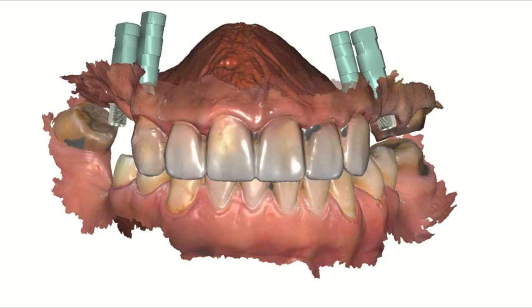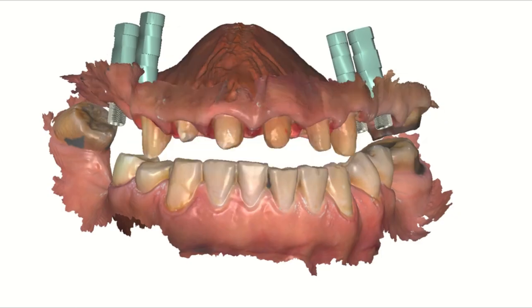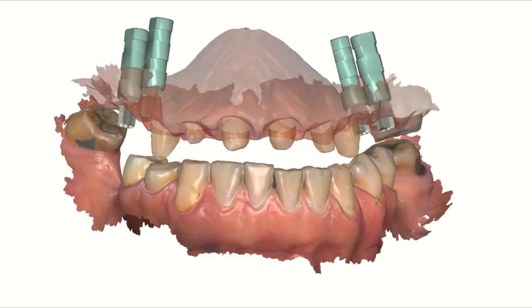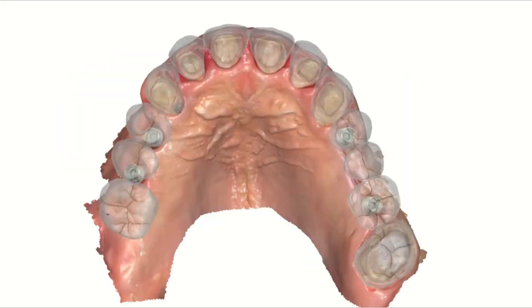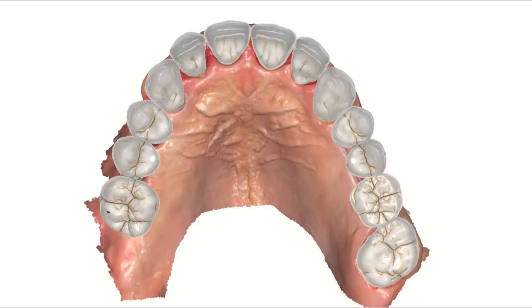Here is the case before preparation of the anterior teeth. Teeth after preparation, losing the original bite in reality, but this bite is still preserved in the virtual software. So in reality we lose the bite, but in virtual, after preparing the teeth and losing the stoppers, we still have the relation between the upper and the lower arch. Here is the design of the screw retained prosthesis and the crown and bridge anterior restorations. Look at the full arch rehabilitation case.